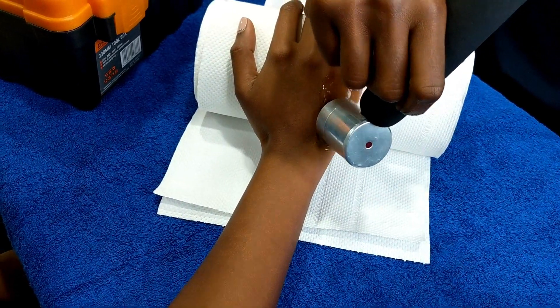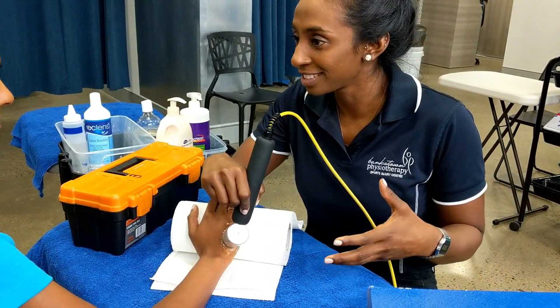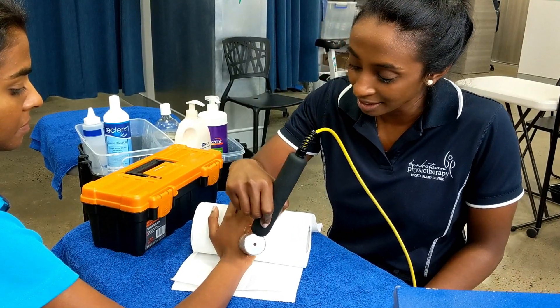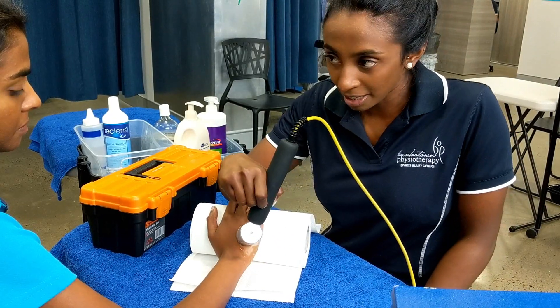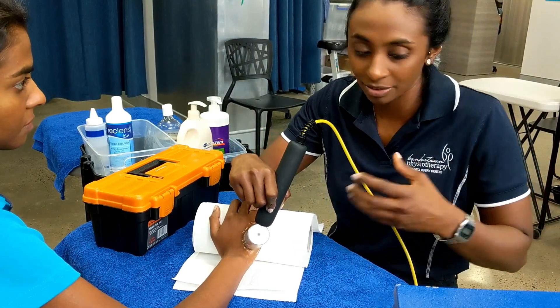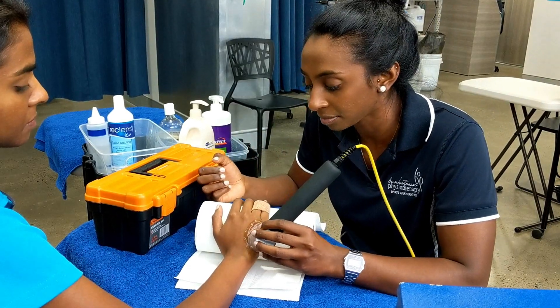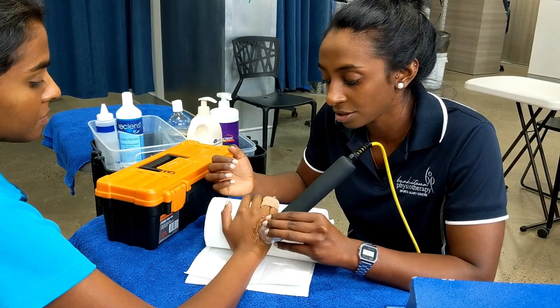Is it the same thing with the belly? If you get pregnant, or fracture or roll your ankle, you want to see what's going on in terms of swelling and soft tissue injury. But this is more of a therapeutic application of ultrasound, as opposed to diagnostic imaging. This doesn't give us an image — it helps to increase blood flow to the area and stimulate bone healing, which is why it's really good for fractures and tendon repairs in the early stages.